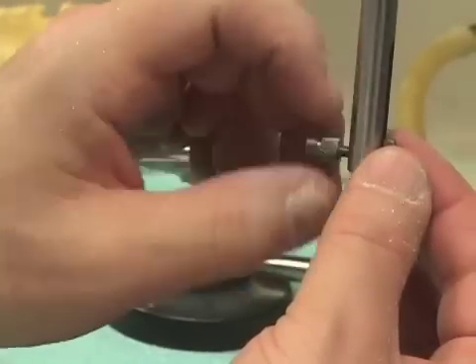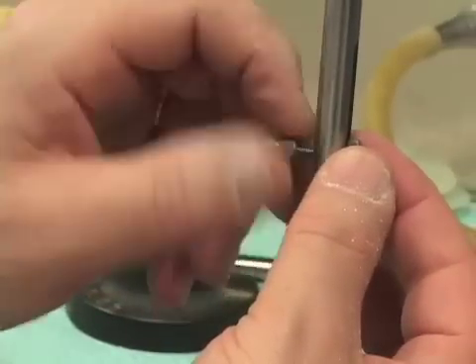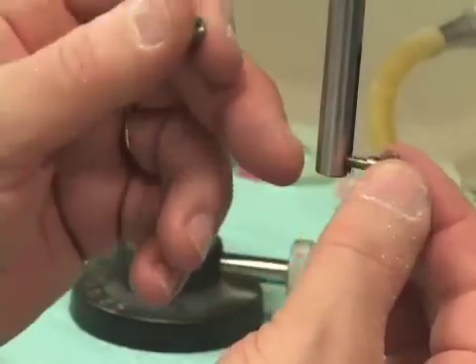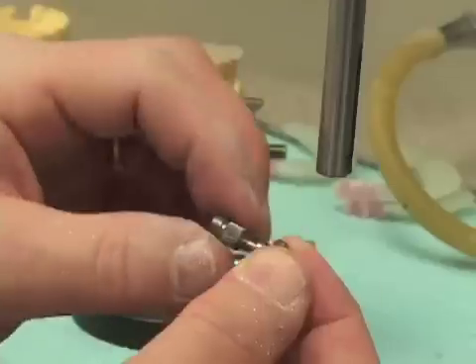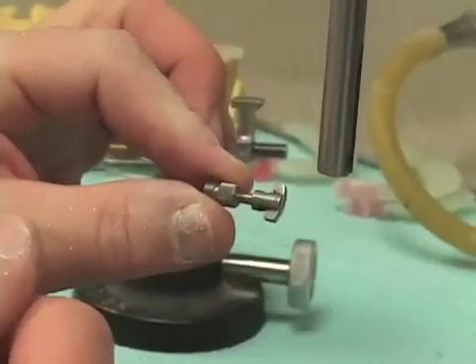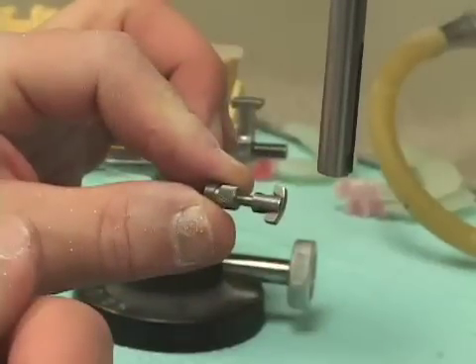Looking at my surveyor here, I want to take the knurled nut that's usually used to hold the tools in place and remove it, setting it aside where it will not be lost.